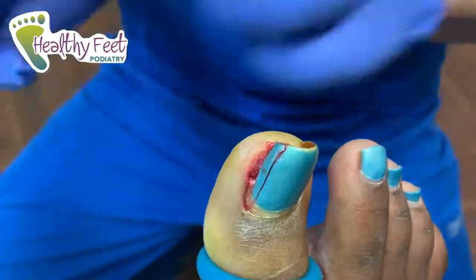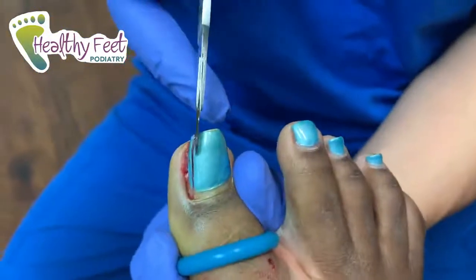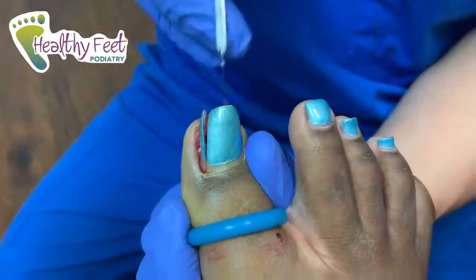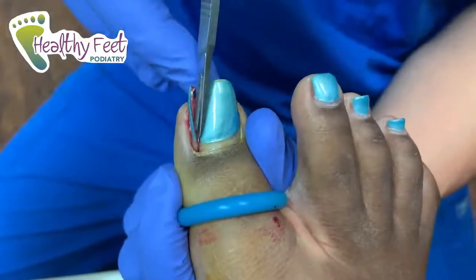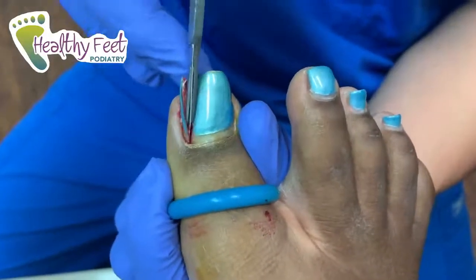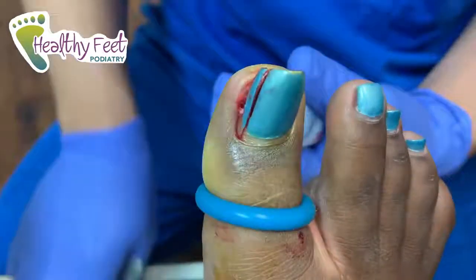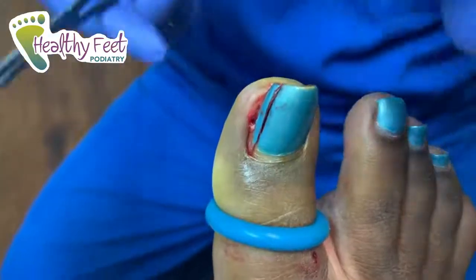Savages. We're a little bit more humane with toenails here. We only take out the side that hurts you. Oh yeah, look at all that gunk underneath there. All right, so we're gonna slide our 15 blade all the way back just so we get all the way back to the root, the matrix of the nail. And so that way when we pull it out, it's one whole unit. We're not leaving anything back there, okay?